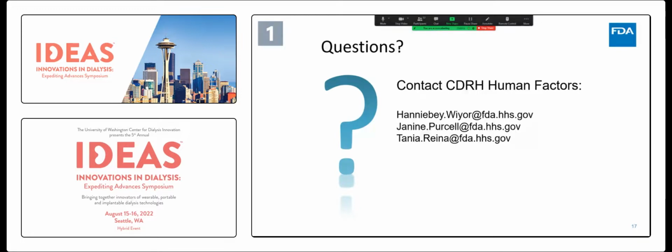Contextual inquiry is what we call it in the business, but really going out there and seeing people use these therapies to understand how your users live and perform the tasks. Invest heavily in your formative testing so that you really can, and listen with an open mind to the results you get during your formative testing, to really take advantage of that time to learn and improve the device design.